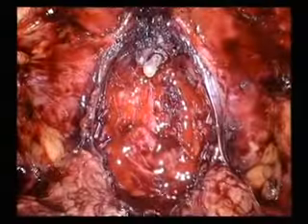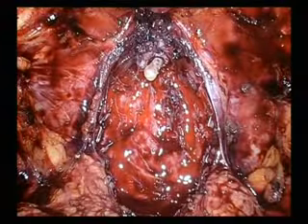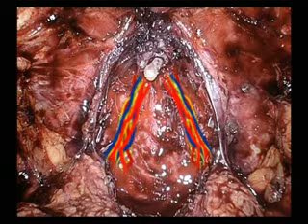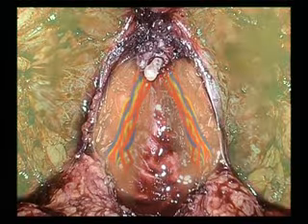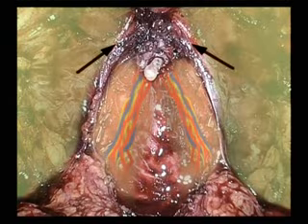The video now shows the result of intrafascial nerve-sparing prostatectomy, leaving intact not only the neurovascular bundles covered by the periprostatic fascia, but also the endopelvic fascia and the puboprostatic ligaments.